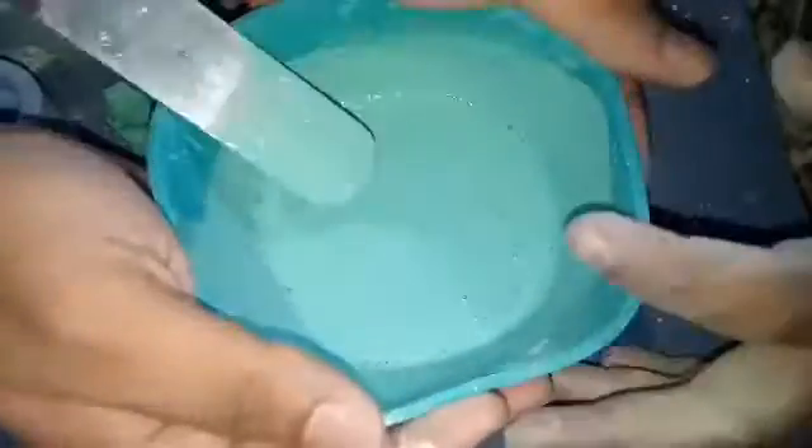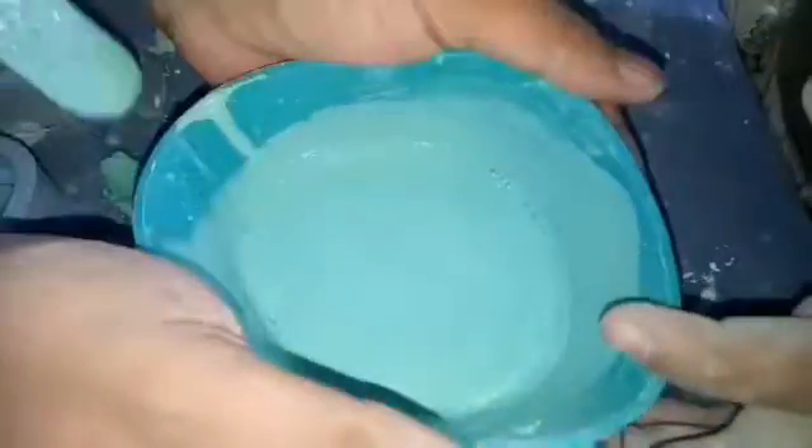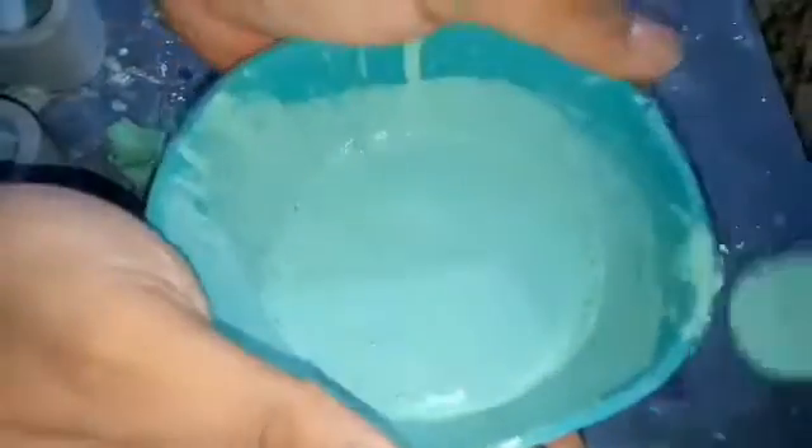Now you can see so many bubbles in this bowl. To remove the bubbles, just hit it slowly on the ground so that the bubbles come out from the ground and there will be no porosity when it becomes solid.